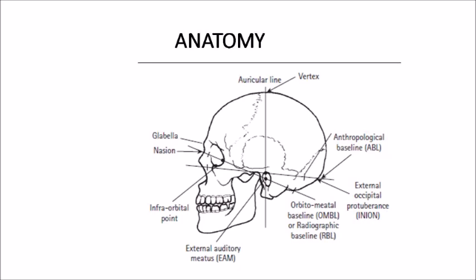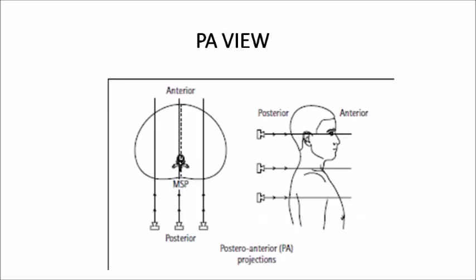There is also the anthropological baseline, which is a line in the vault of the skull. All these lines are used to determine the locations of lesions of the skull — whether skull fractures are on the left, and the line above, below, or medial or distal to this line. Basically, all these are for radiographic diagnosis.